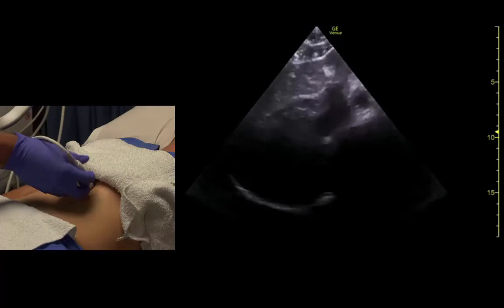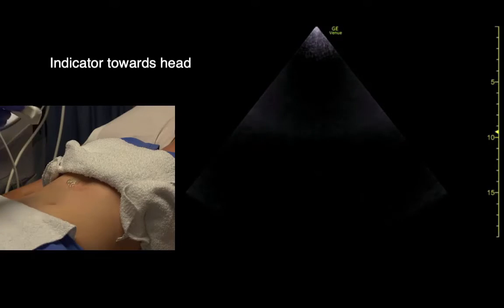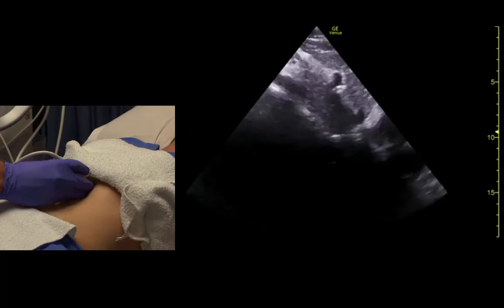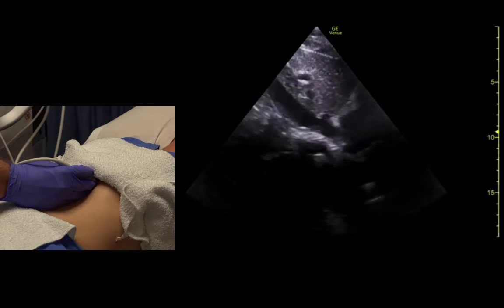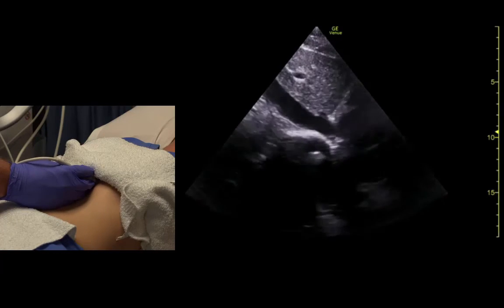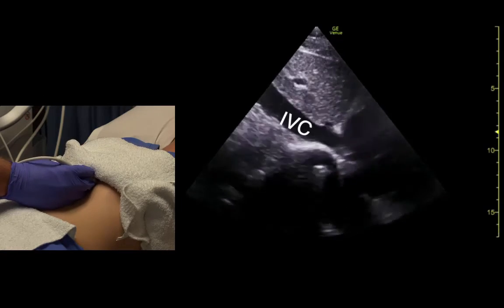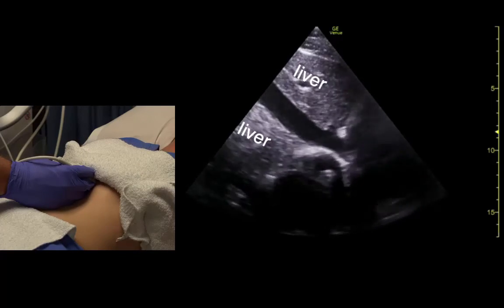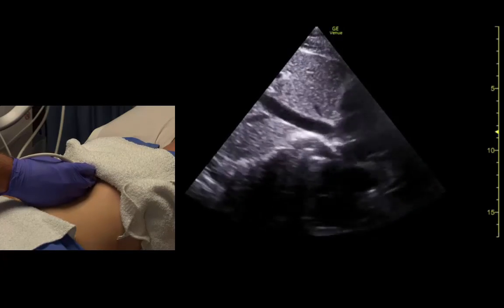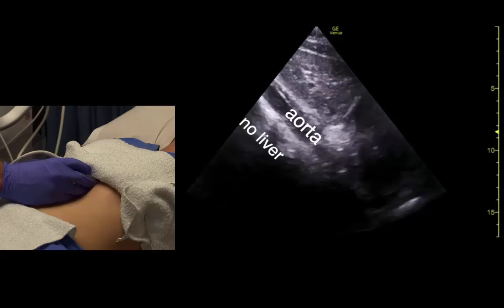A lot of times we'll do the IVC view from here as well. We just get in that position, indicator towards the head, and rock up until we see the heart — a little bit sideways — and we can see the IVC entering the right atrium. We see how it changes shape with respiration. The aorta is right there.